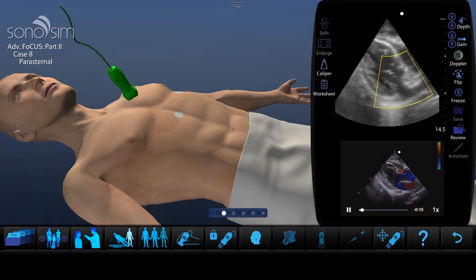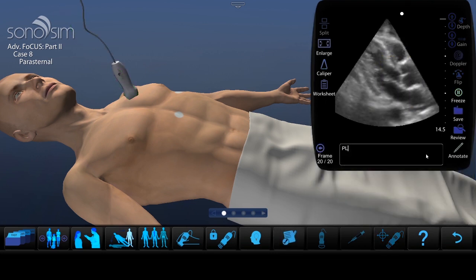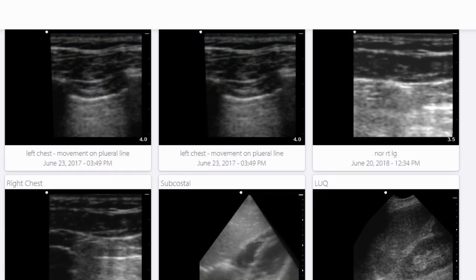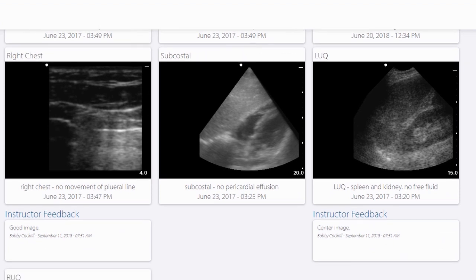Many of the training cases also have Doppler functionality. The Sonosimulator also allows learners to save and annotate images for later review by instructors. You can access these images in Performance Tracker, where instructors can provide detailed feedback and learners can build e-portfolios demonstrating ultrasound progress and knowledge.